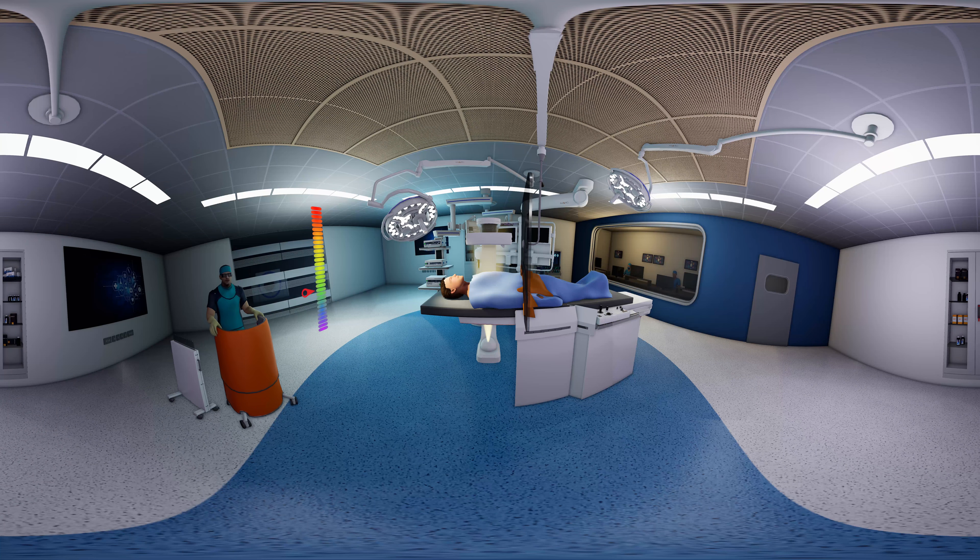The WD261 is a body-contoured, height-adjustable mobile shield that complies with the ALARA principle and reduces further radiation exposure and apron weight. Mobile shield models such as the WD257 can be ideal for anesthesiologists, nursing teams, and students.